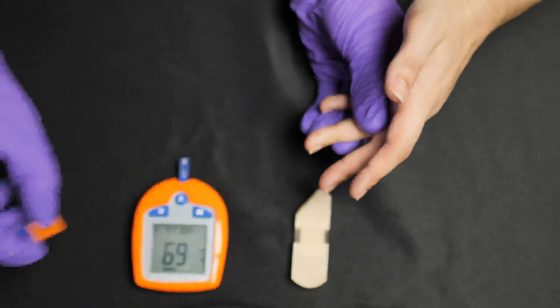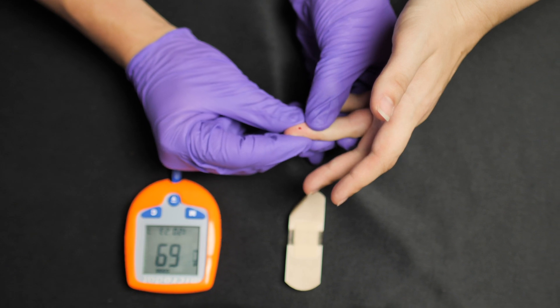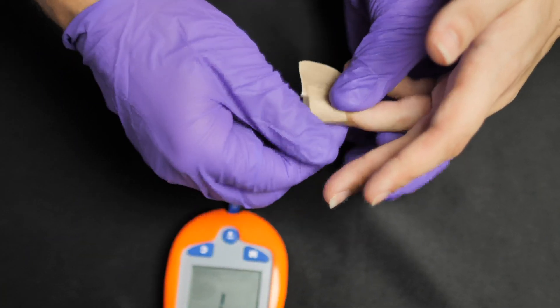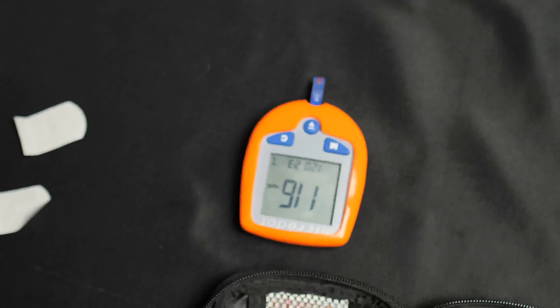Take the lancet and push it down on the side of the finger — you'll hear a pop as it pierces the skin. Apply a little pressure to bead the blood up. Use a dry 4x4 or 2x2 gauze to wipe that first sample away since it may still have alcohol on it. Then press again for your actual sample. Take the glucometer with the test strip and place the end right on the drop of blood. Blood wicks into the strip and a countdown begins. Clean the finger, apply a band-aid, and you should have a reading shortly. If you treat with oral sugar, reassess three to five minutes later to confirm that the treatment was effective.